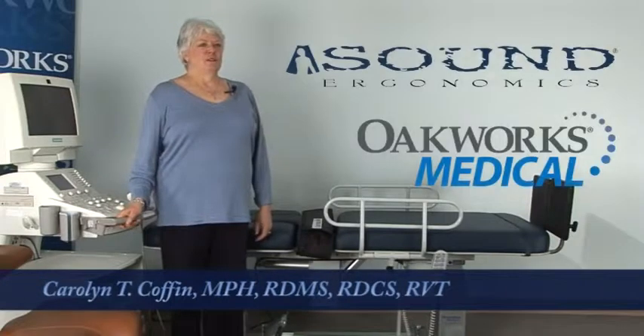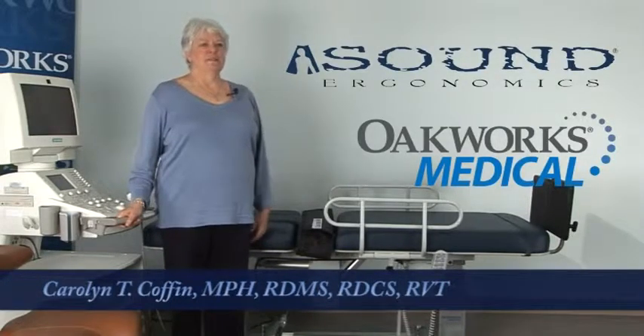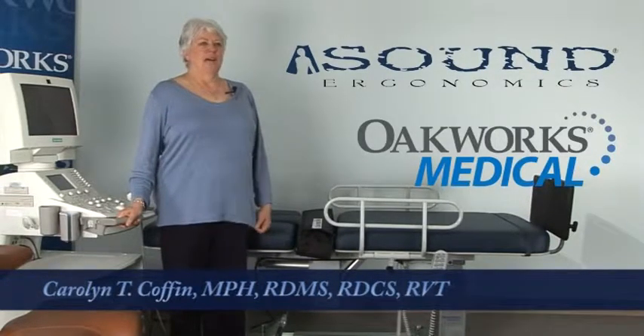Sound Ergonomics has partnered with Oakworks to create an ultrasound exam table line that is both ergonomic and flexible enough to meet the needs of a variety of different ultrasound departments and work styles.